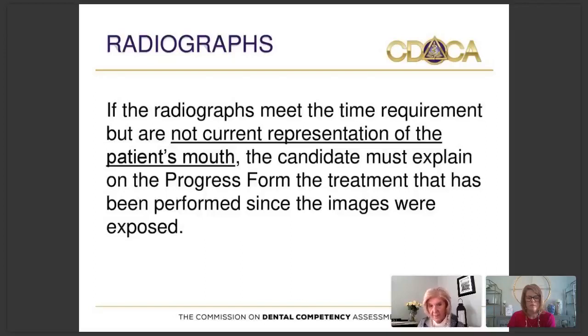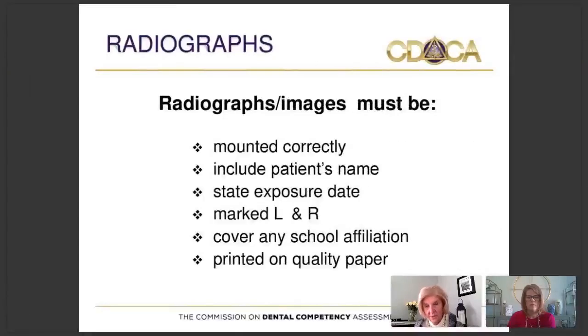It will represent the combination of the radiographs and the notes. It will reflect the current representation of the patient's mouth. Other things that you need to do with the radiographs is that they need to be mounted correctly. They need to have the patient's name and the exposure date. That must be clear so that we know that the radiographs belong to the patient that you're treating.